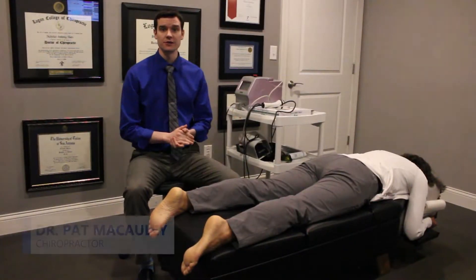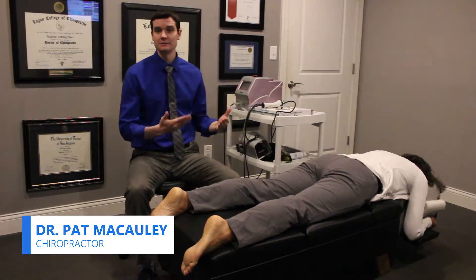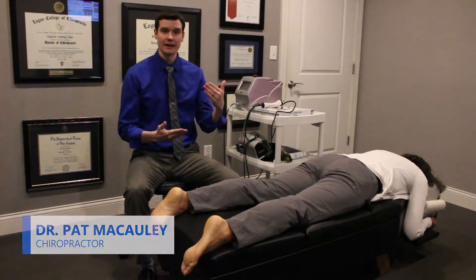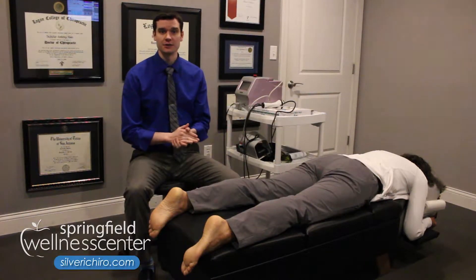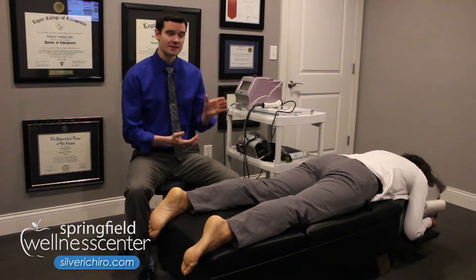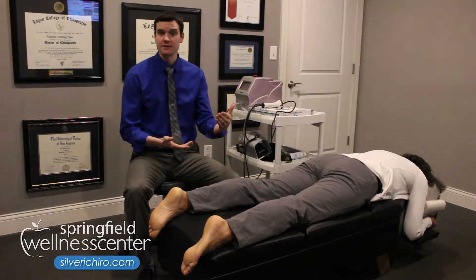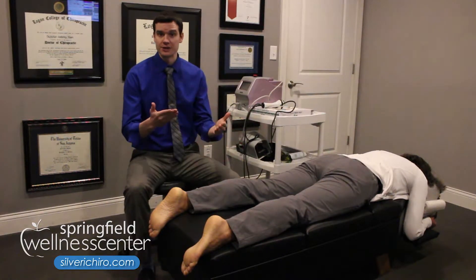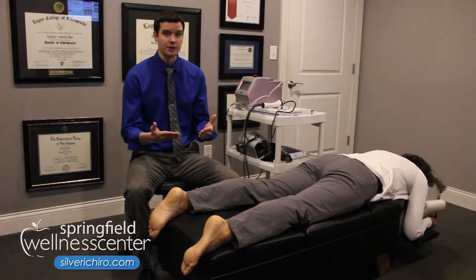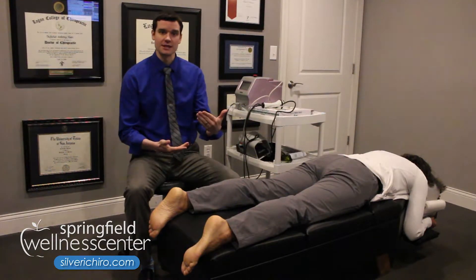There are a few different things that we do here in the office to help treat plantar fasciitis. The first one we do is deep tissue laser. Laser light therapy is really effective for soft tissue injuries like plantar fasciitis because the light energy penetrates really deep into the tissue, down even to the cellular level and starts to create change. That change is what helps to combat the inflammation as well as stimulate the healing process of the tissue.